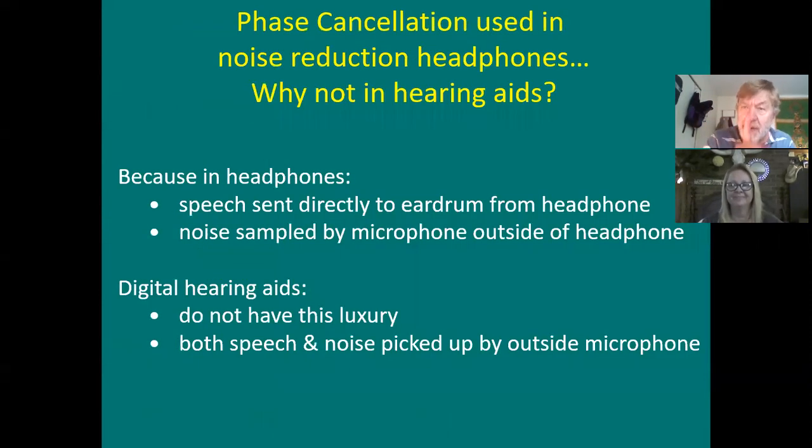Okay? Once again, hearing aids don't have that luxury. Their microphones are sitting there, and they're picking up both the speech and the noise. There's not a separate mic picking up noise and then another sound just coming out of the hearing aid. I mean, hearing aids aren't headphones, okay? So when you've got a headphone set, you've got the luxury of saying, hey, what I want to hear is coming right out of the headphone, and meanwhile, background noise is trying to get in. So I'm going to have a mic on the outside of the headphone that inverts the phase of the noise, so the inverted phase of the noise can be put against the original noise, canceling out the noise, leaving just the speech.